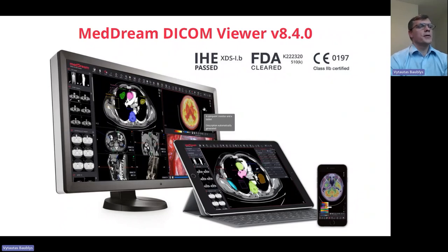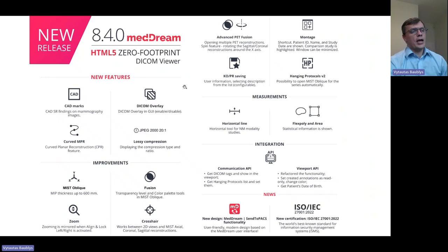Later on, you will see how many features were created. Most of these features were really asked of me for many years, and if you had asked me 7 or 8 years ago, I would have said it's only a dream to have them. And finally, they're on our table.